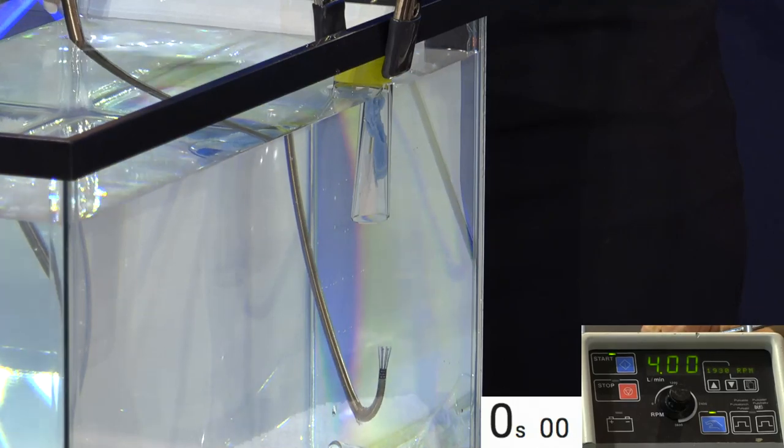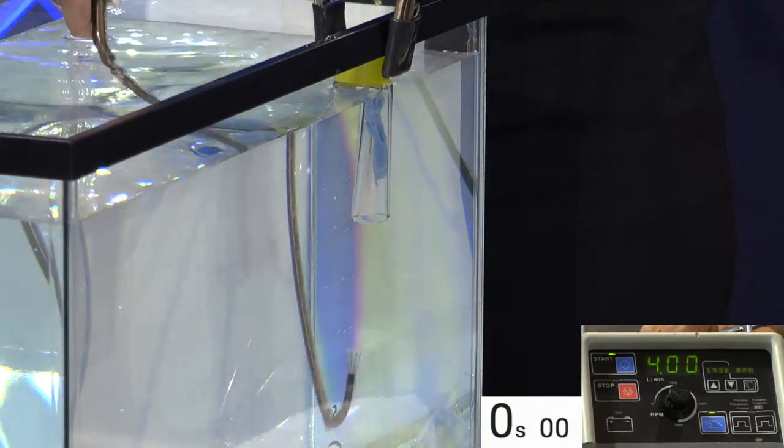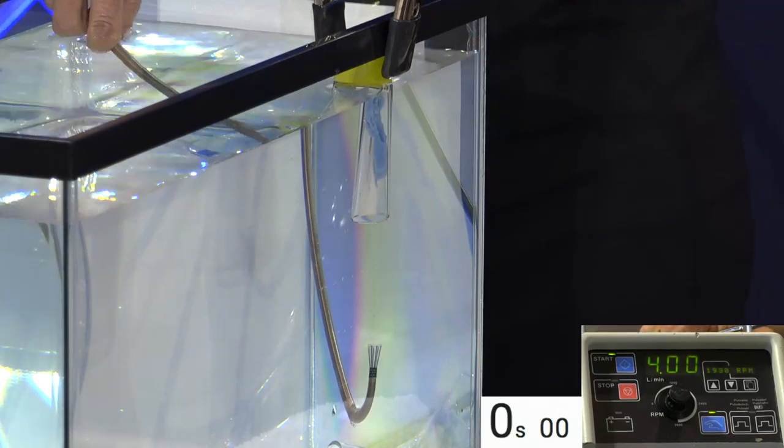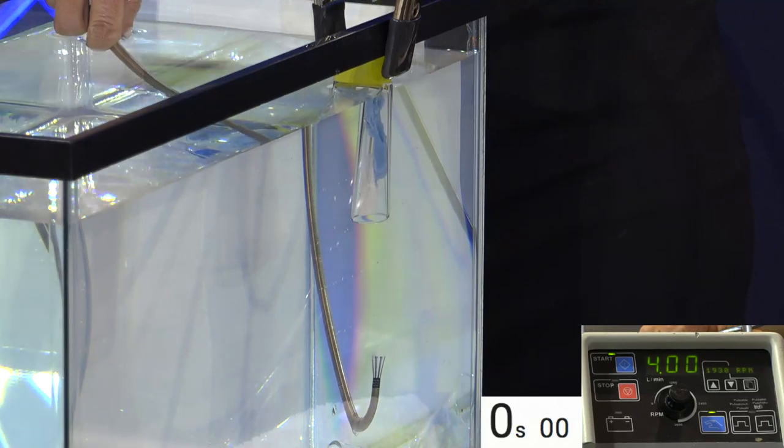Now, I'm going to tell you another recommendation. If you ever were to put a patient that was arrested on VA ECMO, what is the first thing we're going to do? You're going to cool them down to 34, 35 degrees. That's going to buy you more time.